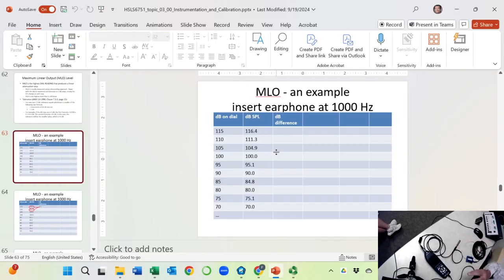Half-inch microphone. Do it very gently. You should feel no resistance when you thread it in. And then the HA2 coupler, put it in, and then the sound tube. Okay, let's put it out first.